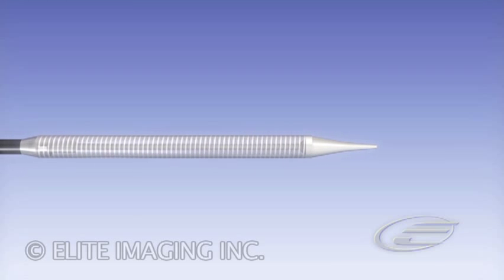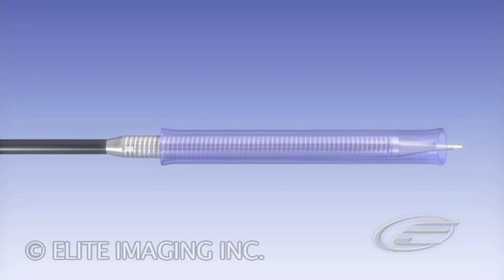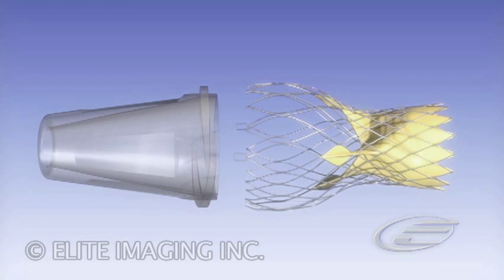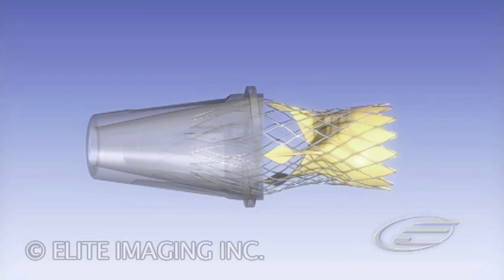Loading the valve. Advance the outflow tube tapered over the catheter tip. Gently squeeze the outflow part of the frame and insert the outflow part of the frame into the outflow cone.